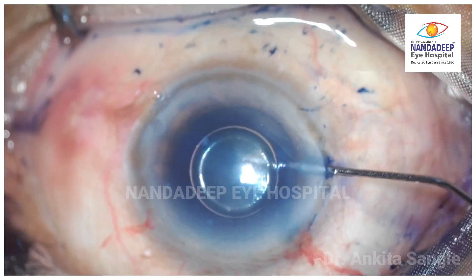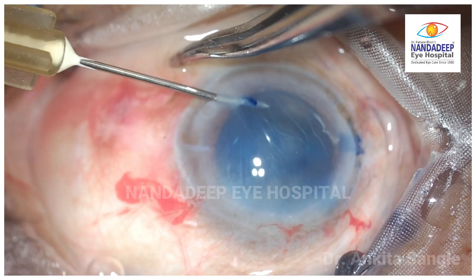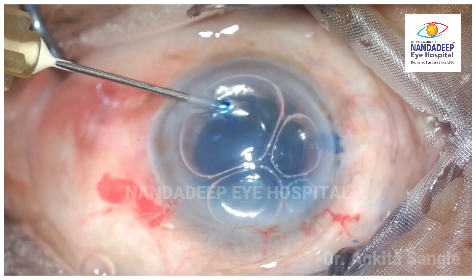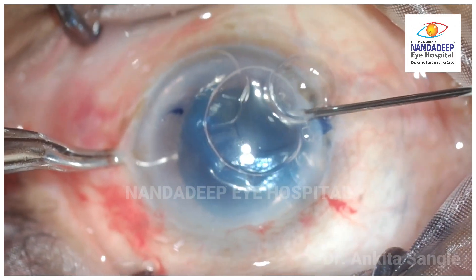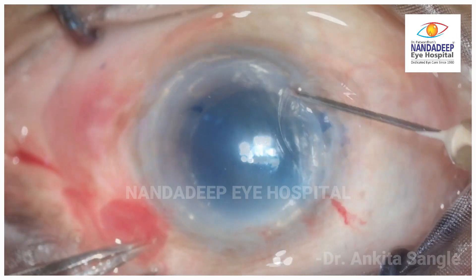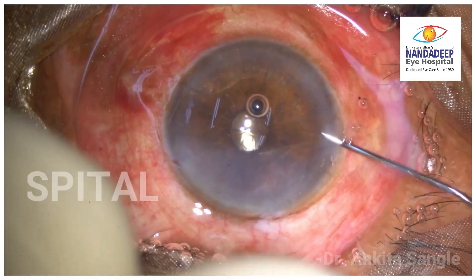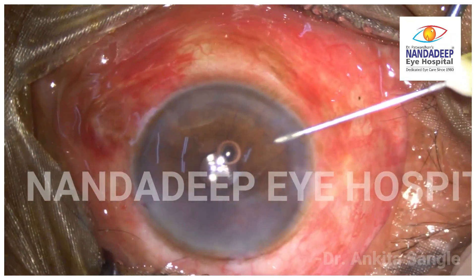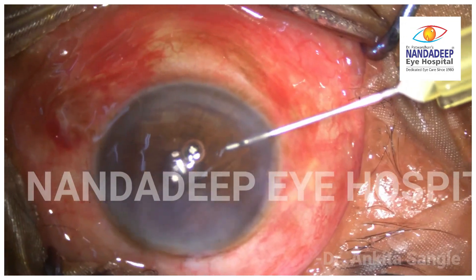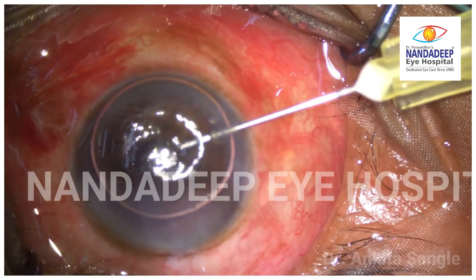In such cases of large Desmet Membrane detachment involving the visual axis, SF6 or C3F8 Desmetopexy can also be done. While injecting the air bubble, a clear corneal area which is away from the detached area is chosen. Using a 30-gauge needle, a tight sterile air bubble is injected into the anterior chamber.